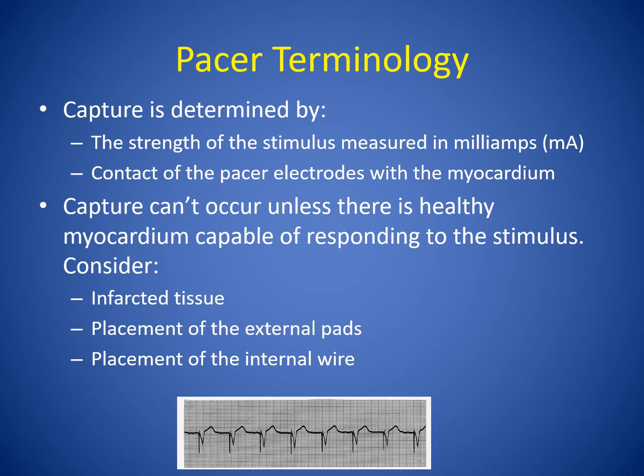And what basically was happening, this person was on multiple pressors and had been there for days, and end of life, the family and the physician were not accepting. The code had already been going on for some time, about 30 minutes, with no viable myocardium to pace. Dead tissue basically is dead tissue. And the patient's own rhythm was a bradycardia PEA, which finally convinced the physician that the milliamps were as high as they can go and they were unable to get capture. And again, it took getting an ultrasound machine to prove to him that there was absolutely no myocardium in motion.